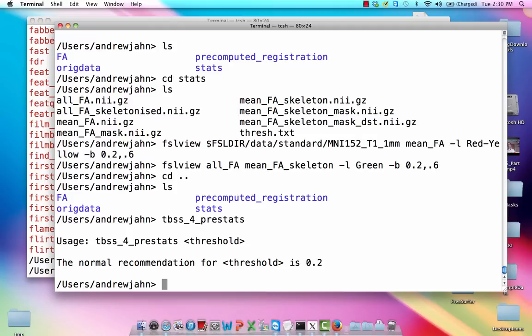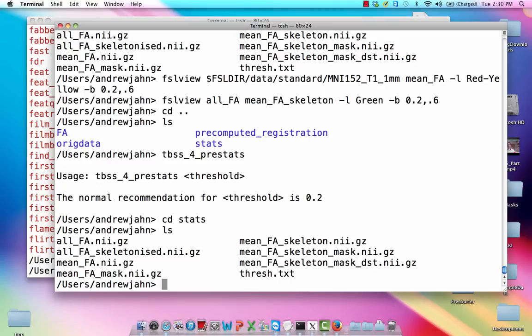but basically it's just going to make sure that there's not going to be any strange connections between different parts of the white matter which should not connect. Okay, so let's say I ran that and I used the recommended threshold of 0.2. Again, this stuff gets sent back into the stats directory. And we're going to take a very brief look at it.